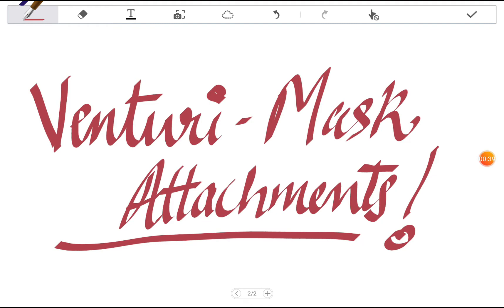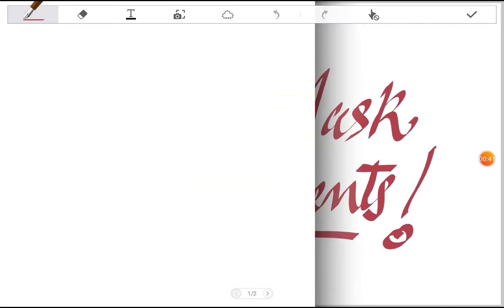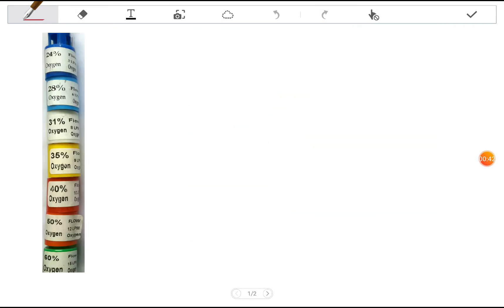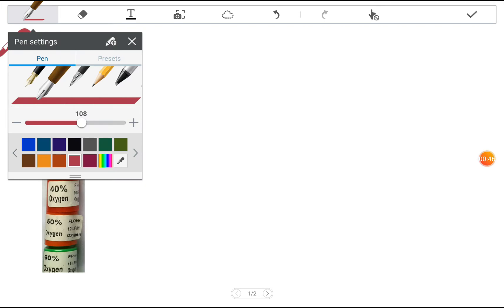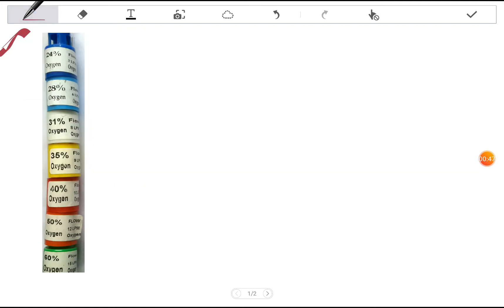I have collected a picture for you of the Venturi mask attachments. These are as follows, which goes like blue, white, yellow, red, orange, and green.